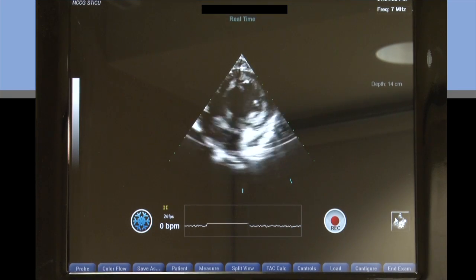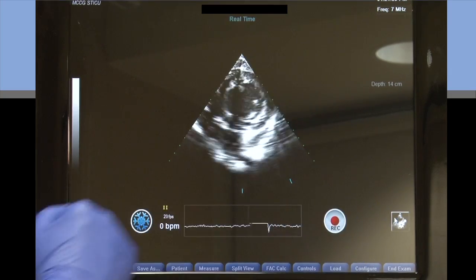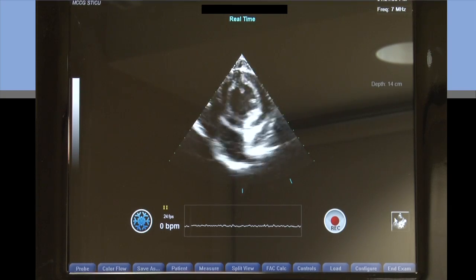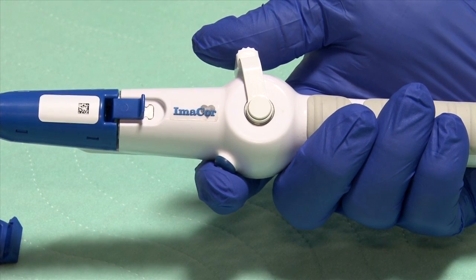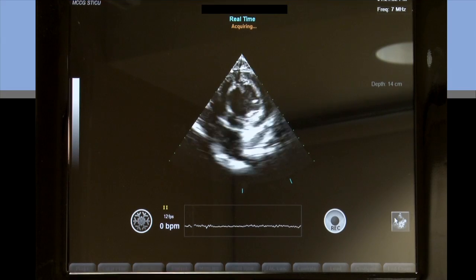Once I get the position that I want, I'm ready to optimize my image by hitting the optimizing button on the screen. Then I'm ready to make my run. I do that by depressing the blue button at the base of the handle, which will give me a run. I want to do that at least a couple of times to make sure I've got good image acquisition, because we don't want to go back and have to repeat that once we've moved on.